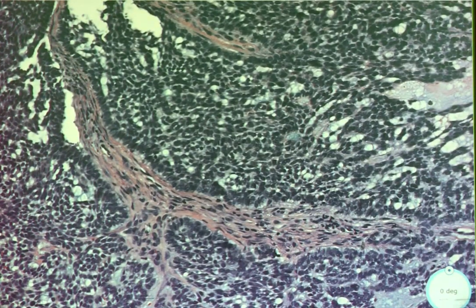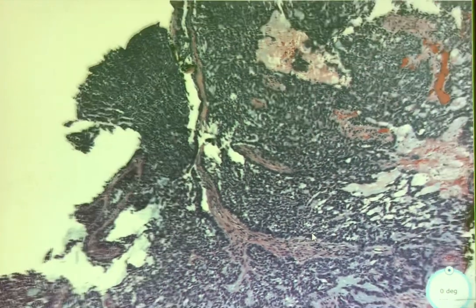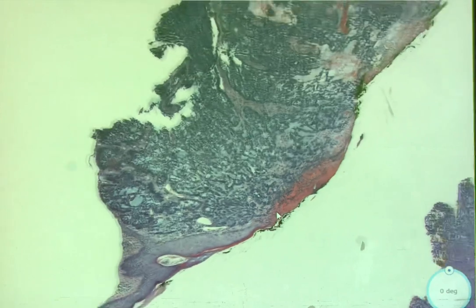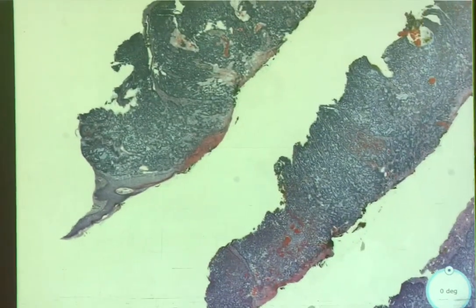Because what often happens with basal cell is they like to mix subtypes. Again, they don't want to be put into one box of, I'm just nodular, or I'm just infiltrative. They're like, you know what? I'm nodular and infiltrative. I'm superficial, too. Deal with that. So they will do all kinds of things. This one also has some cystic type areas. So there's lots of different subtypes, but recognizing the cells, the epidermis being relatively benign, you can have areas where it will attach. And basal cell carcinomas like to ulcerate, right? So we're actually seeing the ulceration. Good job. The other pieces, they all look alike. It's just some of them have even less epidermis, so it's harder then to tell where you're supposed to look. But this piece has epidermis.